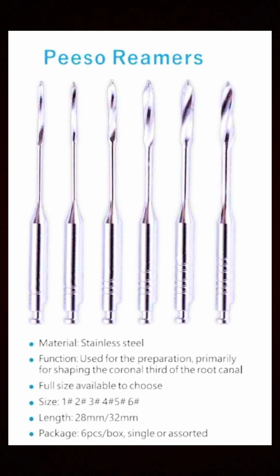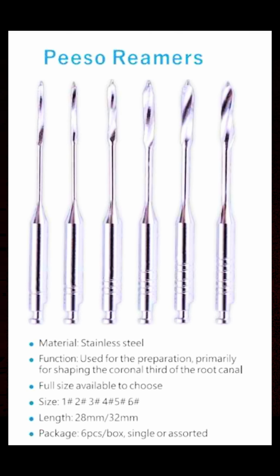This alloy consists of 55% nickel and 45% titanium by weight. The superelastic alloy does not exhibit proportional strain under stress. This unique property is due to the austenitic crystalline structure of the alloy.